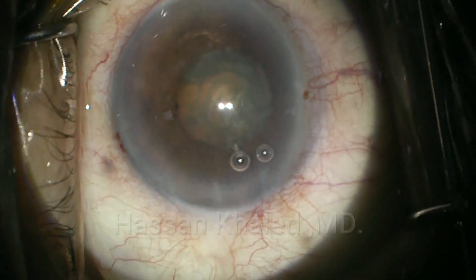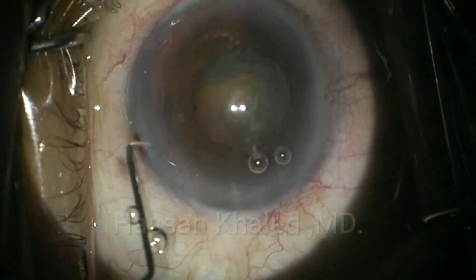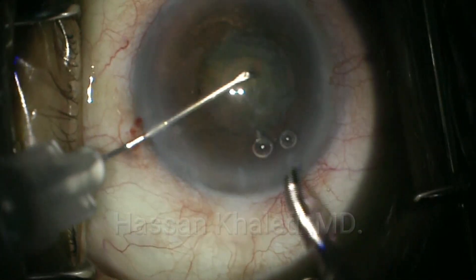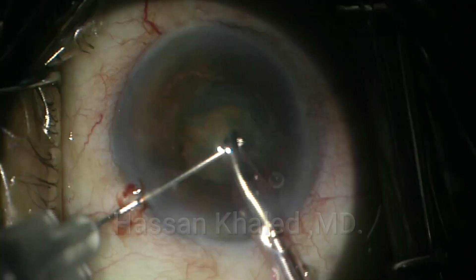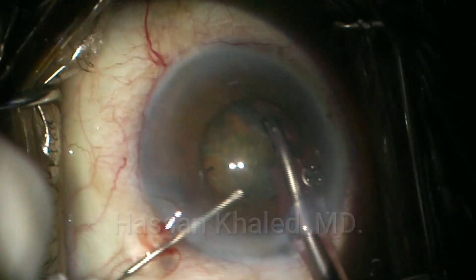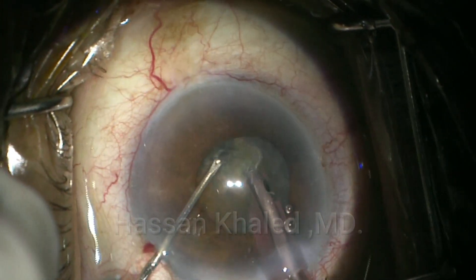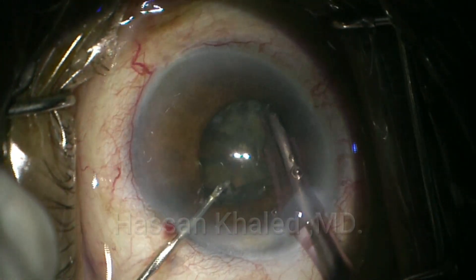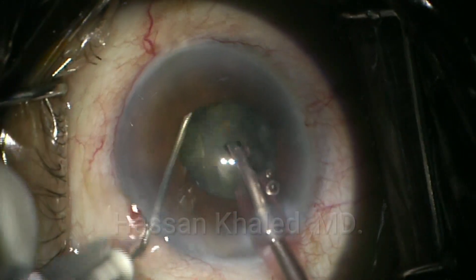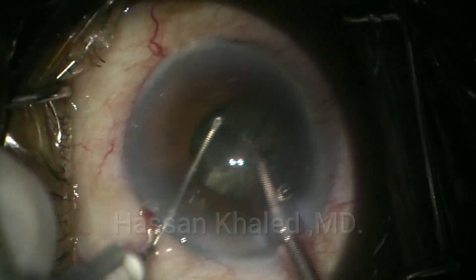Now you can introduce your vertical chopper through the paracentesis and introduce the phaco probe through the main phaco incision. Do shaving of the cortex and epinucleus as it's clear. Then embed the phaco tip, with the vertical chopper descending right in front of the phaco tip. You can see a complete separation of the nucleus into two halves. You can repeat this technique for each half.